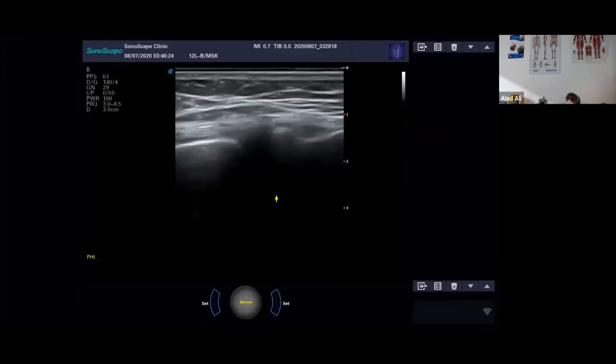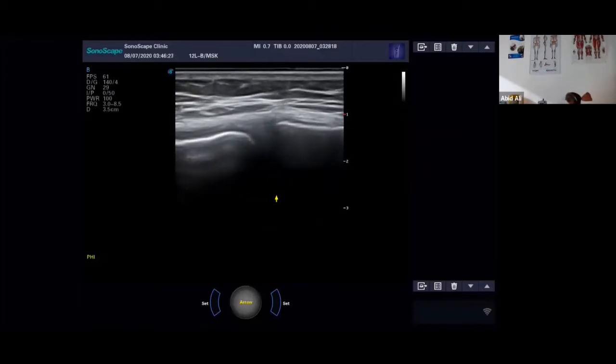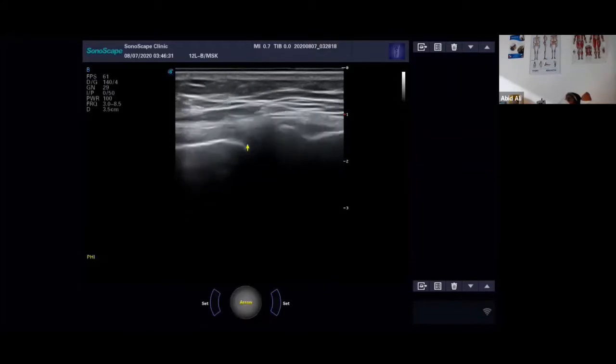I would say it's protruding. If I look here, you see how it does actually look like it's just dislodged and slightly out of place when you see it. Yeah, protruding. You see the medial collateral ligament going straight across, and there's no bulging of that ligament. So if the meniscus bulges, that ligament will bulge. Yeah. So if I see that contour of that ligament bulge, then I'll say that it's protruding. Yes. And that's as simple as I call it.